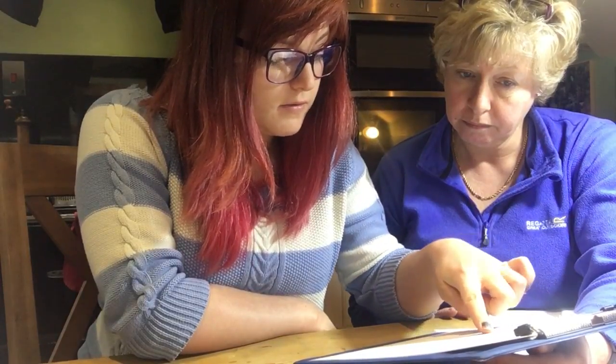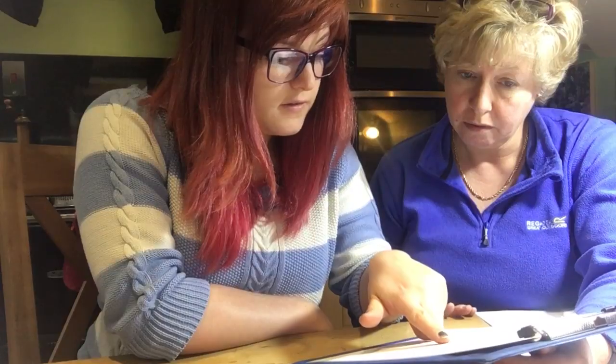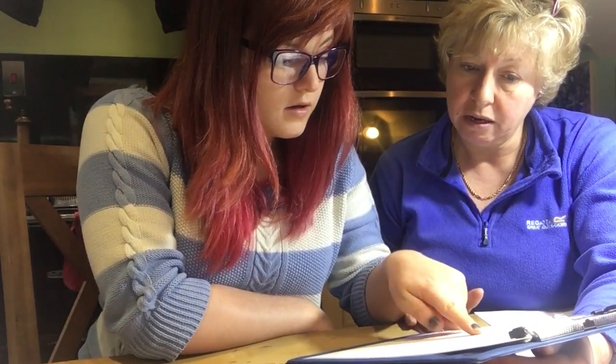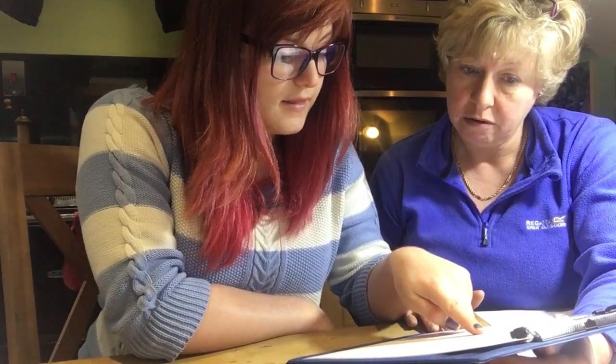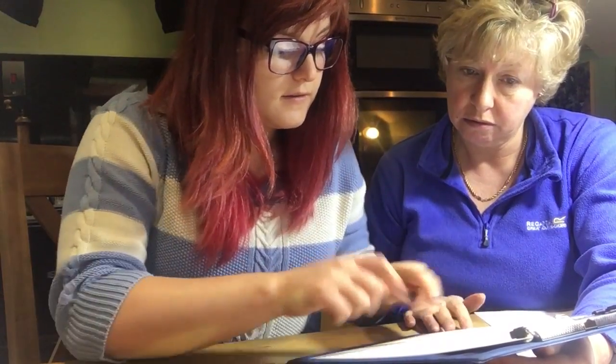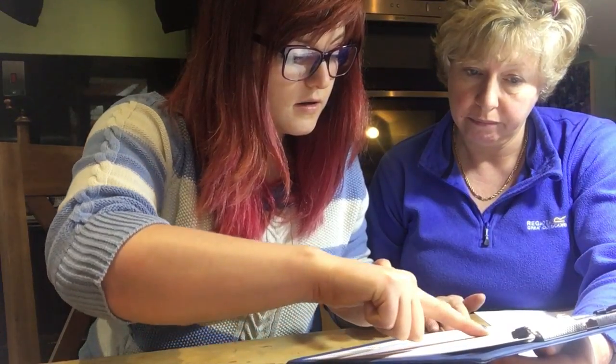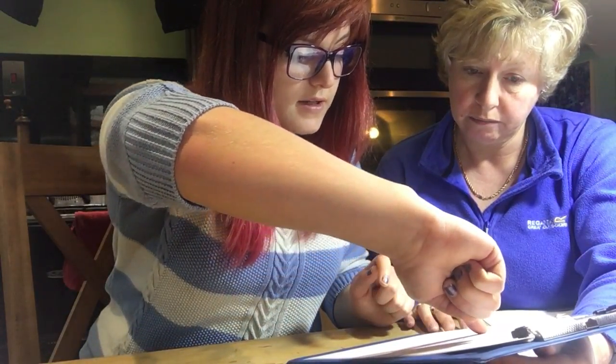So if I move it around this halo of fuzz. Apart from over here, it's much clearer over here. Right top quadrant seems to be... I can't see this here. That's fine. I'll use a different finger. I can see all of this. And we're back into fuzz.